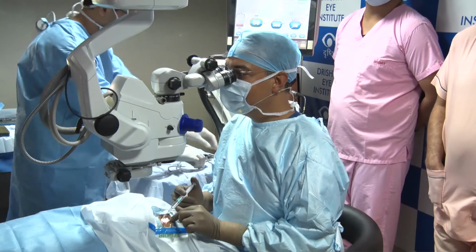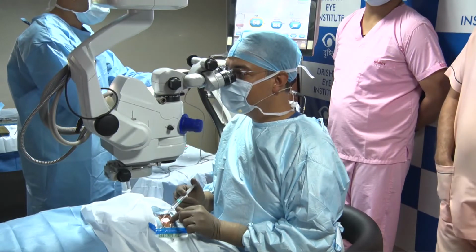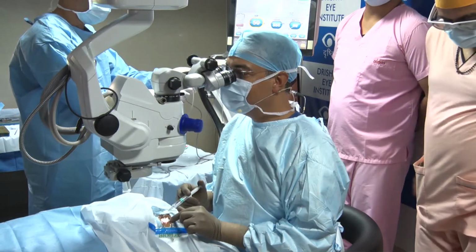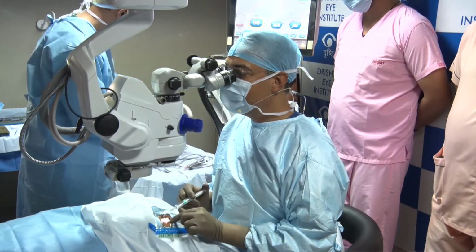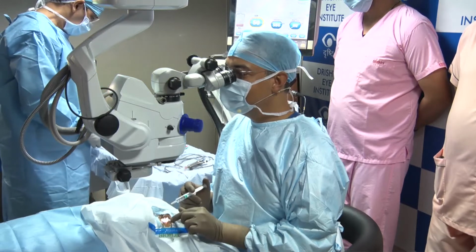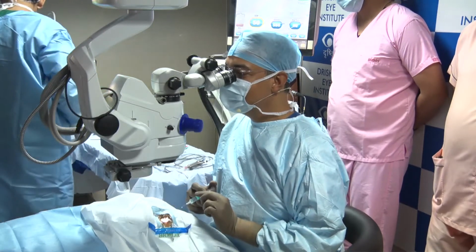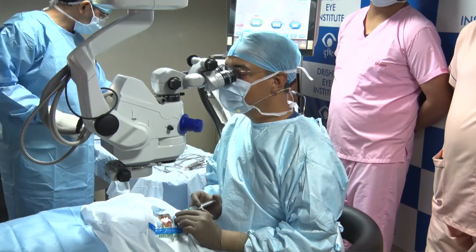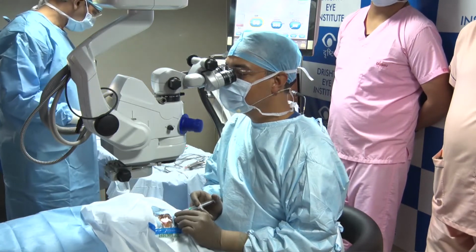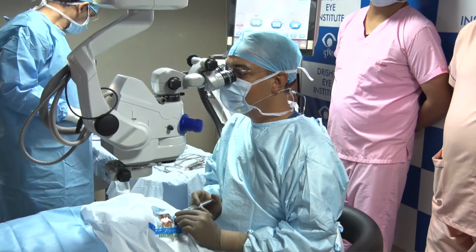And also now, sir, there are zero powered IPCLs available. They've made zero powered IPCLs for people who want to practice putting a zero powered IPCL in a cataract surgery, in a pseudophakic patient. They've made some special new IPCLs which can be used by surgeons for this aspect.